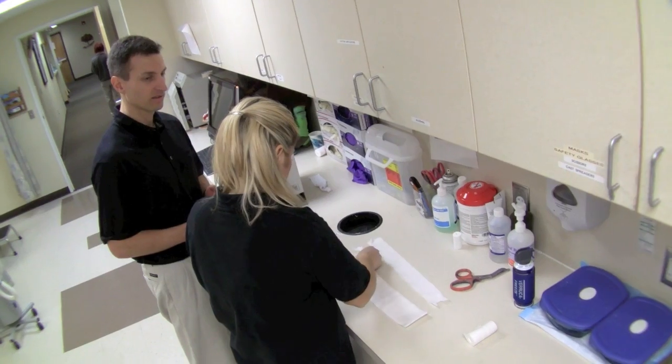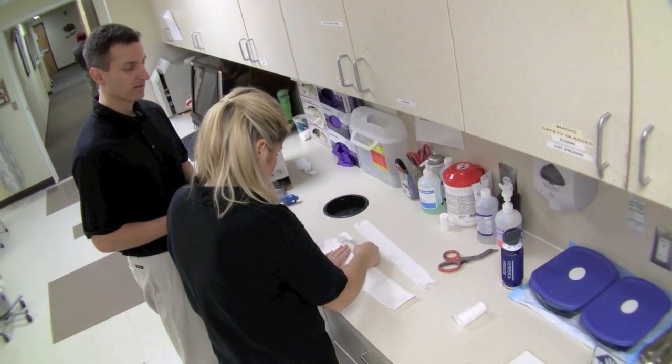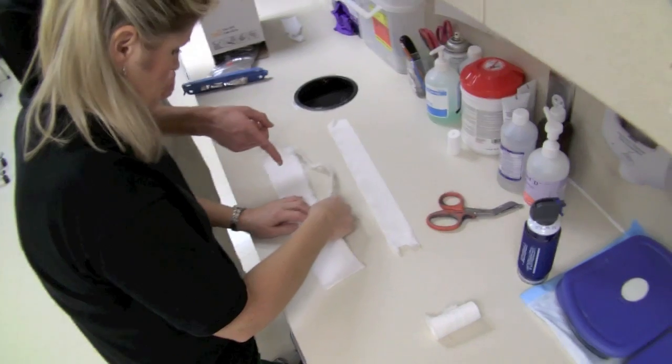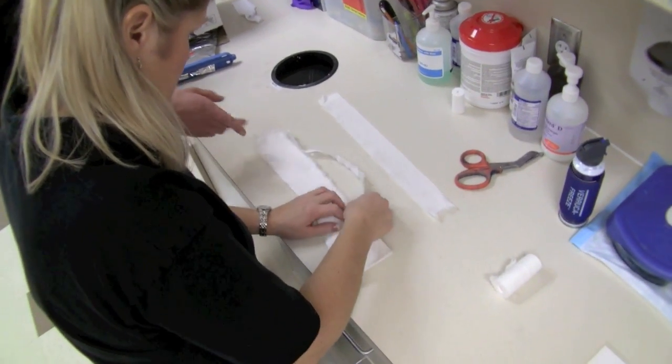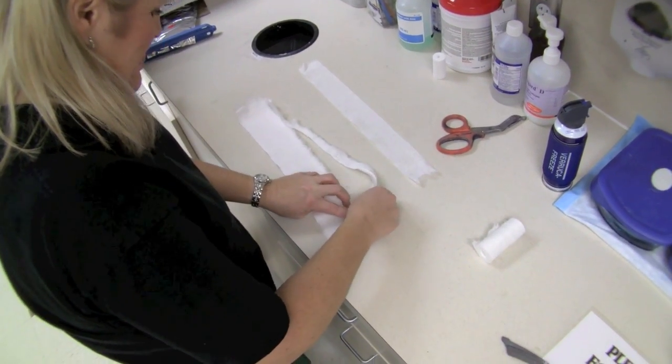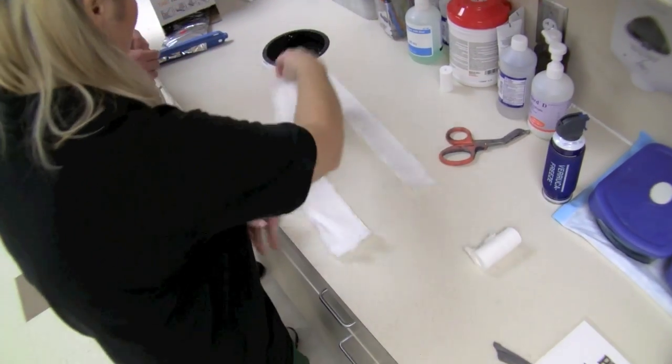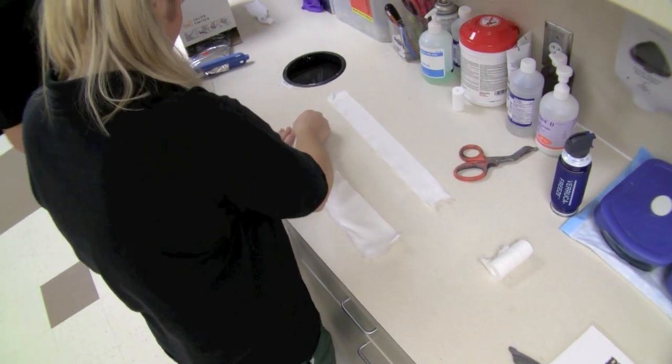One thing you can always do is trim the edges. Every time Janelle puts on a splint, she trims the edges to make sure it's not going to irritate the skin. Now that's the artistry — that's for splinting 101. You don't always have to do that, but if you want to get the A-plus on your exam, there you go.